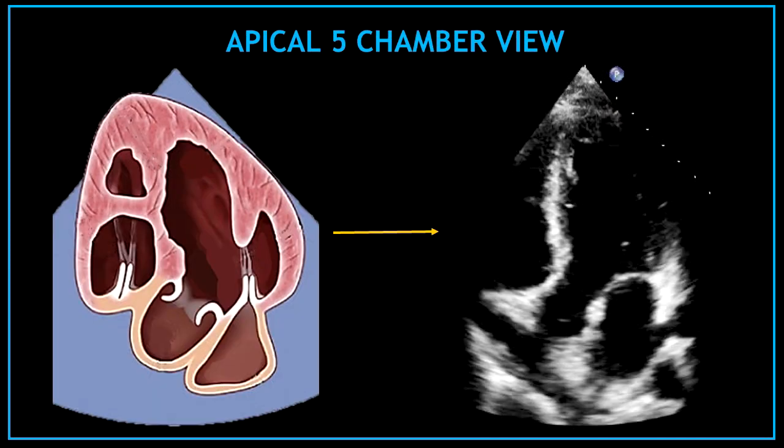This is the apical 5 chamber view and the structures visualized in this view are very similar to the ones visualized in the apical 4 chamber view. So I highly recommend you to start with that video before continuing with this one. However, let's review some of the same structures we can find in the apical 4 chamber view and then I'm going to show you what new structures we can find here in the apical 5 chamber view.